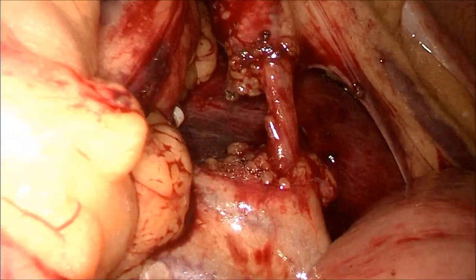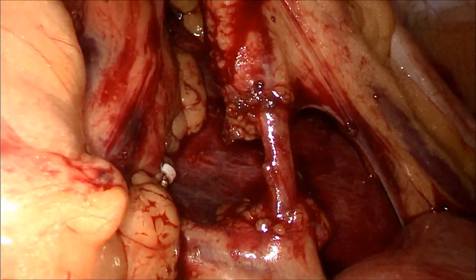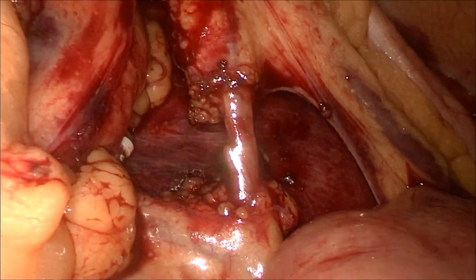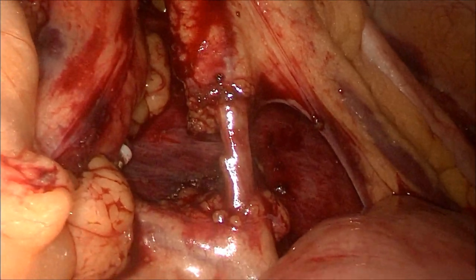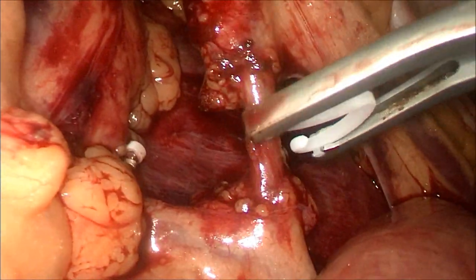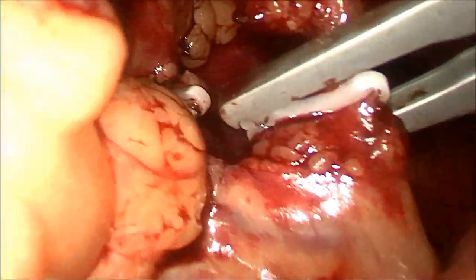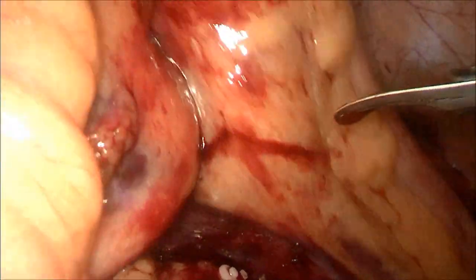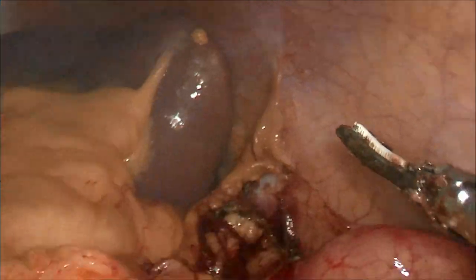Another proximally arising first sigmoid branch from the IMA is also being clipped and divided. This helps us make the descending colon specimen easily mobile, facilitating its retrieval through the extracorporeal incision and anastomosis.